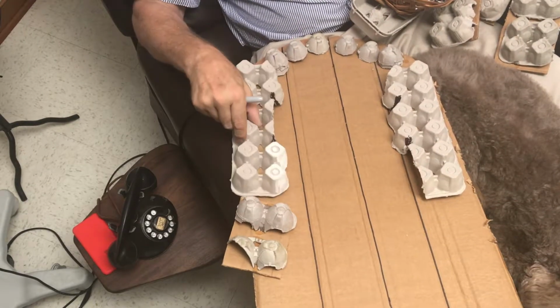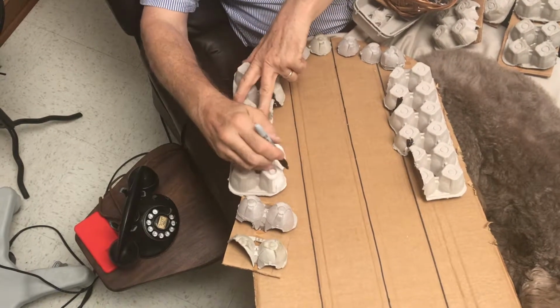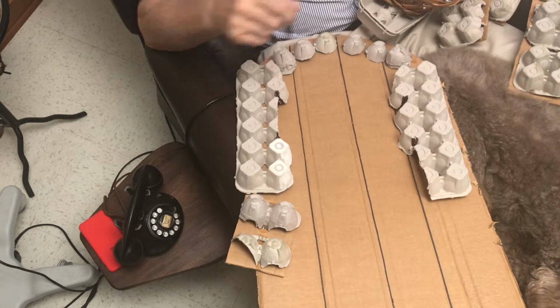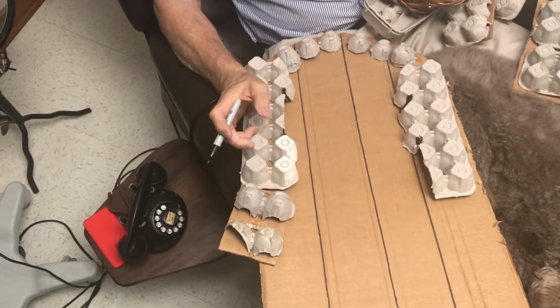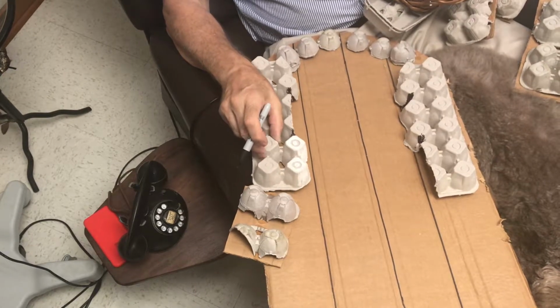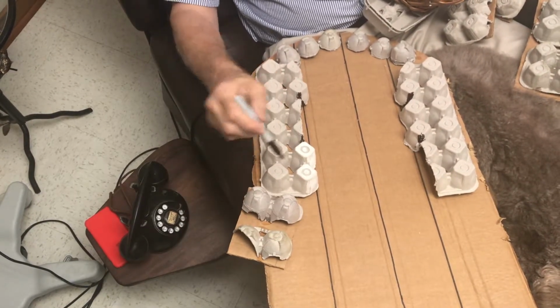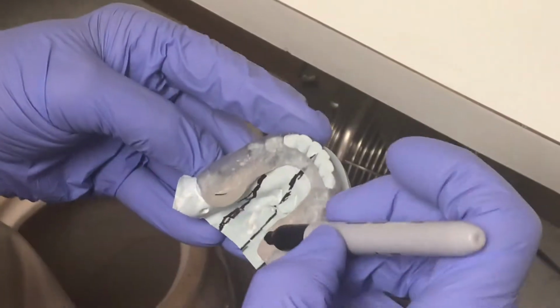So if you could imagine that with acrylic, we can paint this whole thing white and then watch how the tongue comes in. Now, as I said, if the third molars are there, we usually don't get excited about dealing with them because they're too close together in the back of that little triangle that's formed.